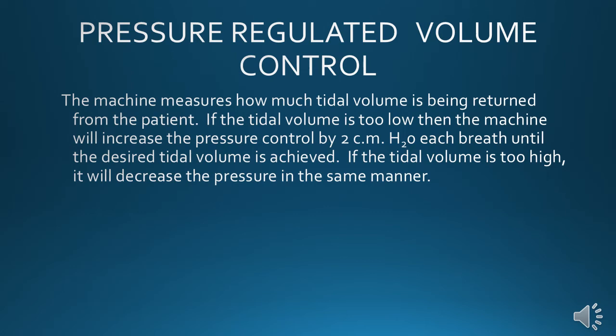Now in PRVC, there are smaller changes, so you're less apt to cause the same kind of airway damage as you could if you used traditional volume control ventilation. And again, the benefit here is we can get a more guaranteed minute ventilation in PRVC than we can in pressure control. So you can see how we kind of take the best of both worlds from pressure control and volume control and put it into one particular mode of ventilation. Now it has its drawbacks, and we could go on and on about that, and later there will be more in-depth videos coming on each particular mode. But for right now, that's all you really need to know.